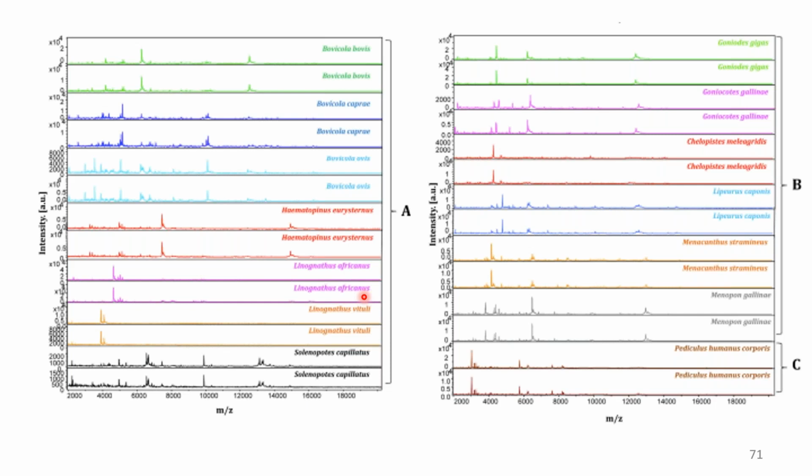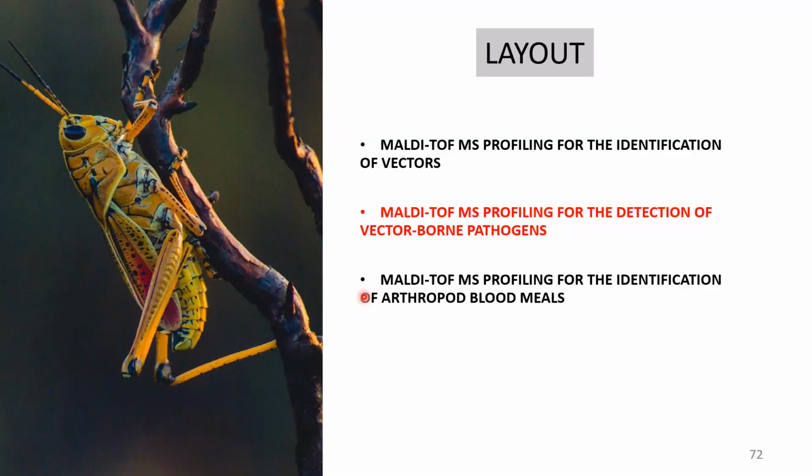This work was probably one of the most challenging for us. As I was saying, we had nothing to rely on. Basma really struggled to acquire a document that would help us identify those lice. And at some point, we almost gave up for some species and decided to rely solely on molecular biology. And what we saw is that the sequences were either not there, which was the case for so many of those lice species, or just completely wrong, with people submitting sequences of poor quality or samples that were inaccurately identified in the first place. So it was really challenging, but now it is really nice to have this tool that will allow us to identify all the species without all the limitations of the other techniques.